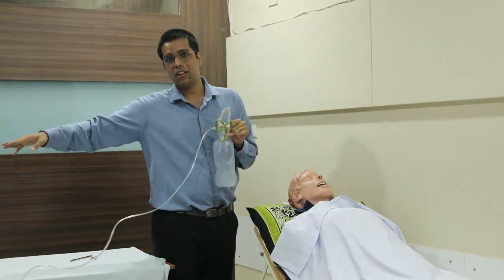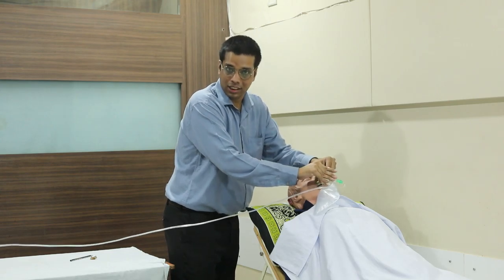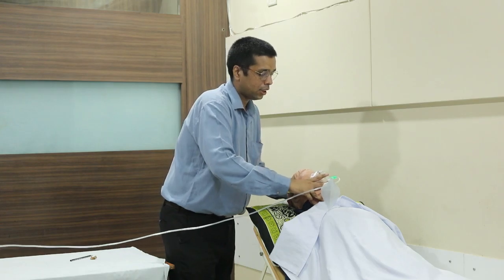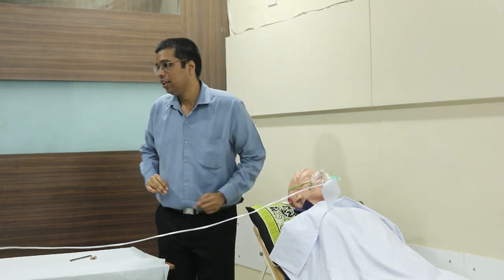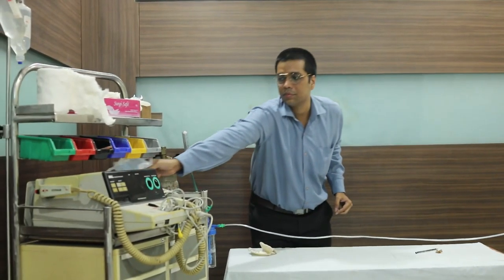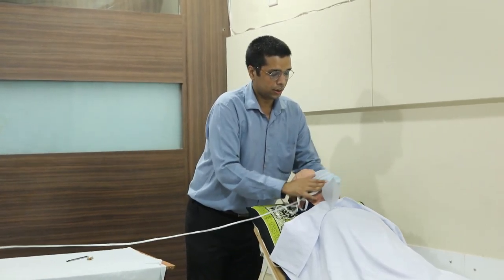I have set the flow to 12 litres per minute. I will apply the mask on the face of the patient. I have taken consent and all personal protective equipment. After applying the NRBM, there are chances of aerosol leaking outside. So I will take a surgical mask and apply the surgical mask over the patient's face.